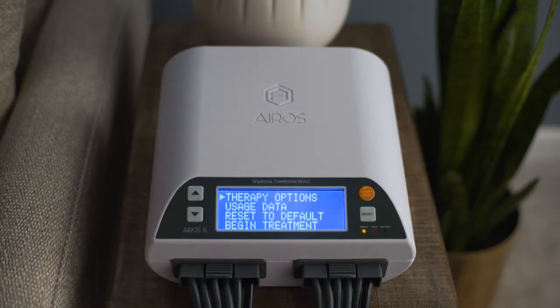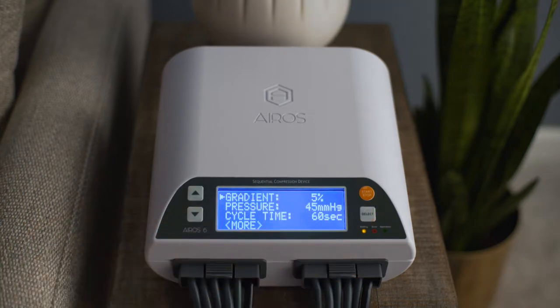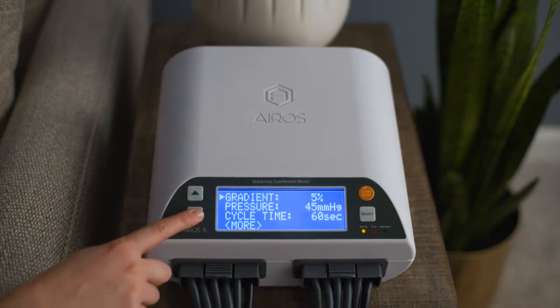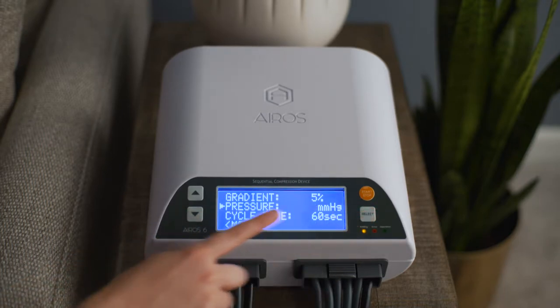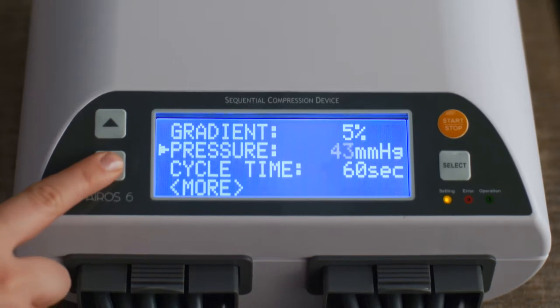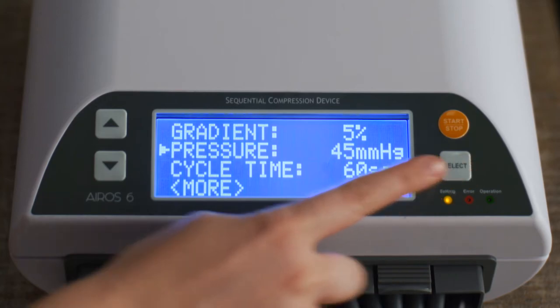From the main menu screen, scroll to Therapy Options and press the Select button. To set the pressure, scroll to Pressure and press the Select button. Pressure can be set from 30 to 80 millimeters of mercury and changed in increments of 1 millimeter of mercury. Press the Select button to confirm your selection.